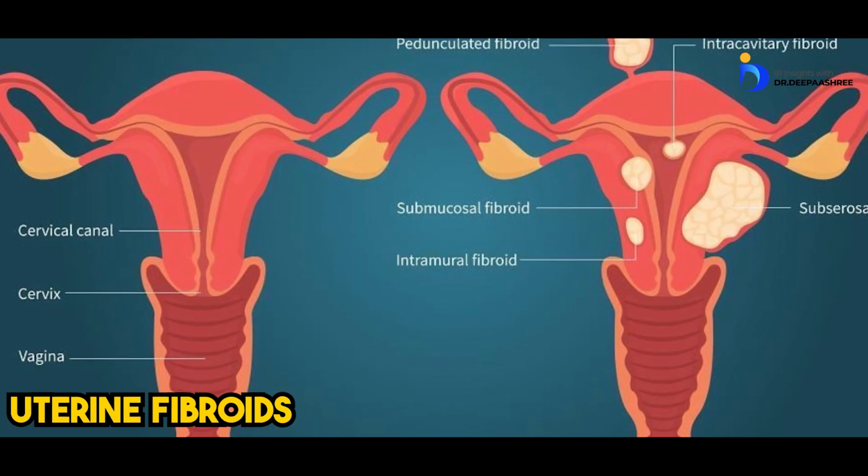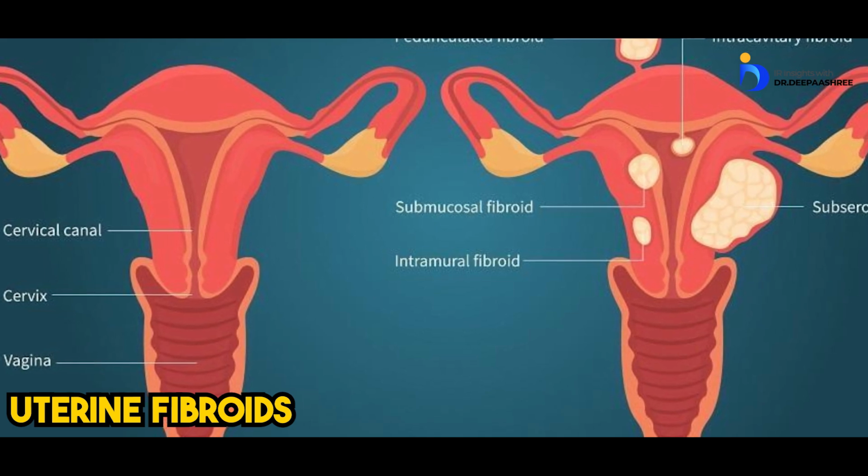How about uterine fibroid embolization? Uterine fibroid, again, we're looking at a permanent embolization because we want to shrink it.